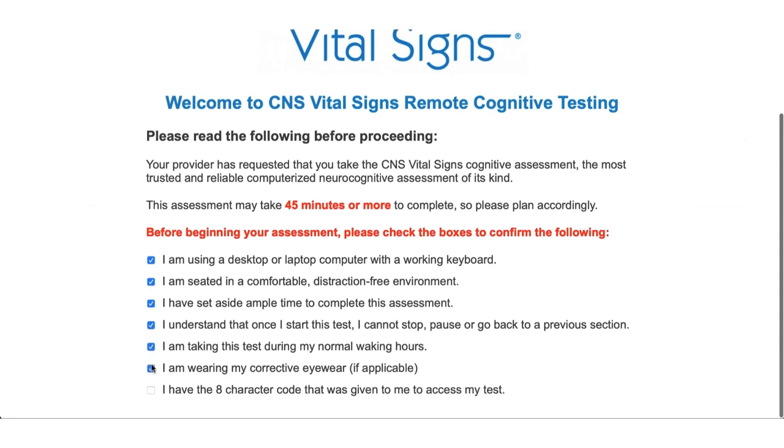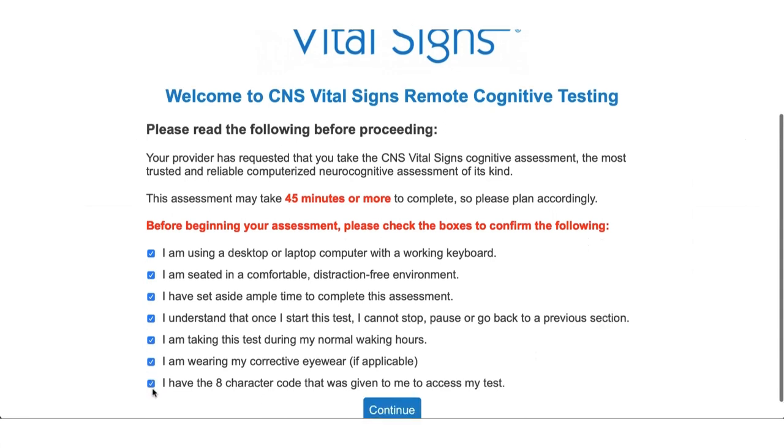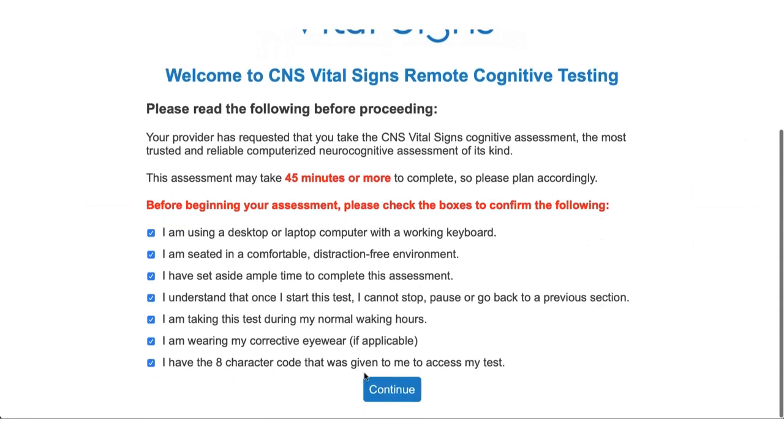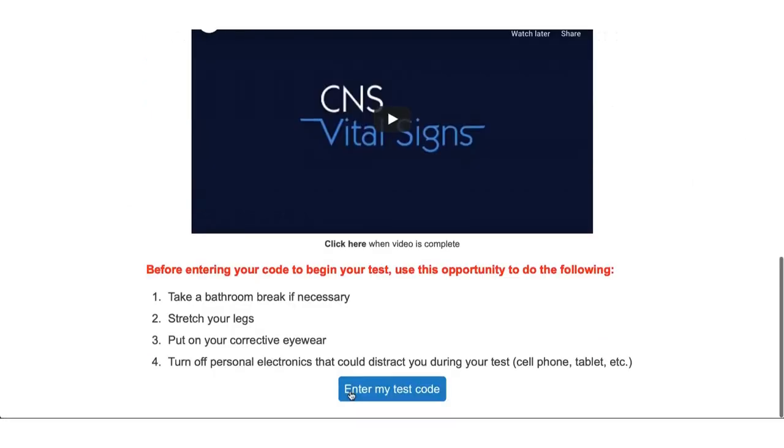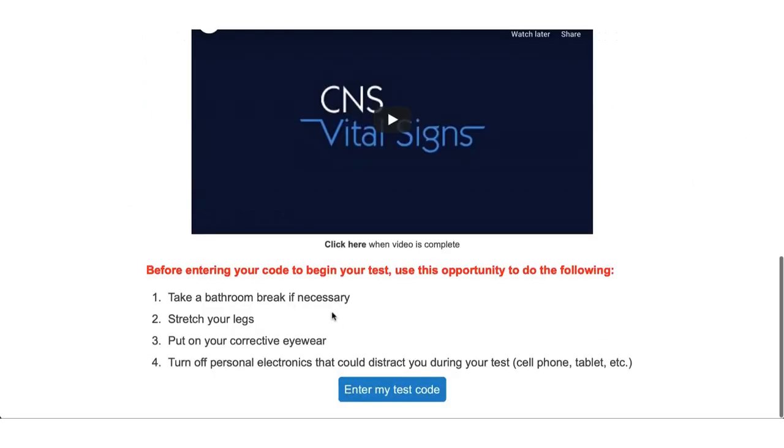Going back to the testing site after you confirm the following you will see a continue button pop up here which will prompt a video that has a lot of great information to make sure that the testing environment is standardized and it's going to produce great data for your patients. When the video is complete the patient can click to continue.